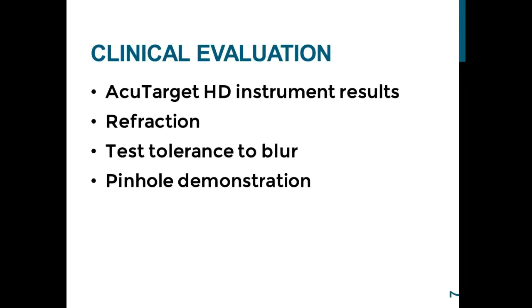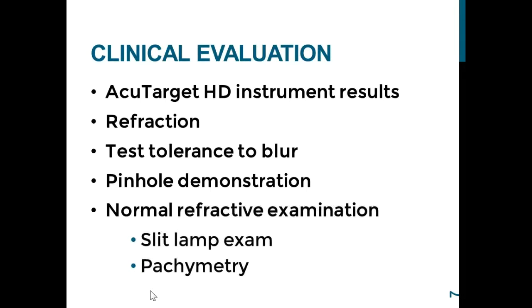And then we do our normal examination, our normal refractive examination, obviously slit lamp, pachymetry, everything else that we have to do. And then, I've definitely found it really helpful to explain to a patient, showing them that pinhole, so that they can actually see the difference once they've got that pinhole in front, how this is going to improve their vision up close. They're kind of shocked that it works so well because it's such a simple device.